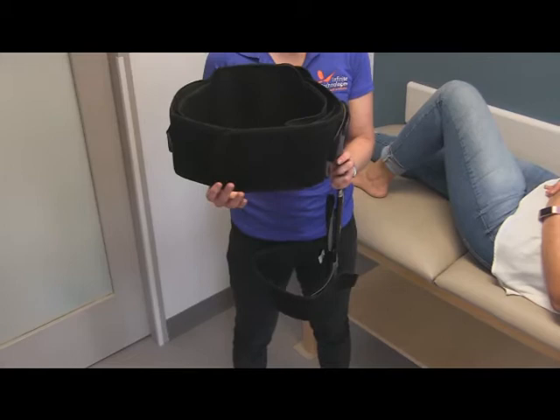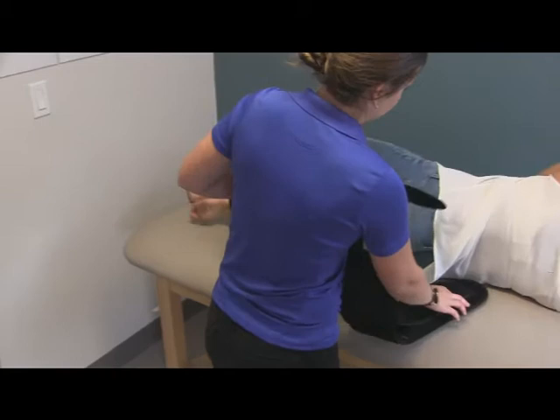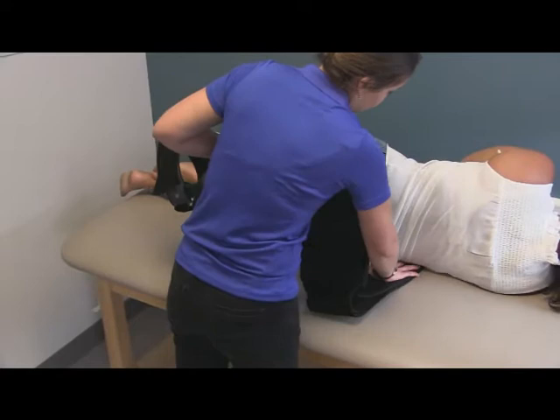The way that we're going to fit this is with the patient laying down. What we are going to have her do first is log roll onto her right side, keeping her hips and shoulders in alignment and onto that right hip.